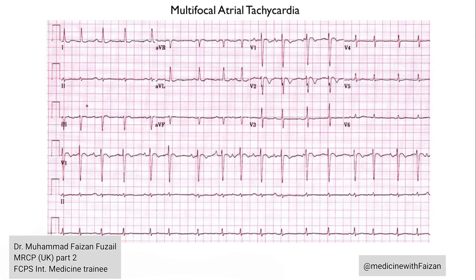Here's another example. The rate is just a little over 100. Looking at the p-waves, some are flat, some biphasic, some flatter, some taller, and one is very tall while another is very early with two phases — almost as if electrical signals are originating from different parts of the atrium at the same time, competing with each other. MAT is a disturbance in calcium handling within the cells, and often these patients respond best to calcium channel blockers like verapamil. But this is a fairly rare arrhythmia that we don't see too often.